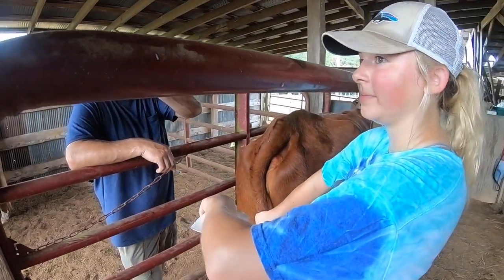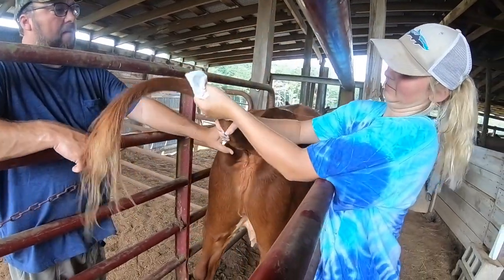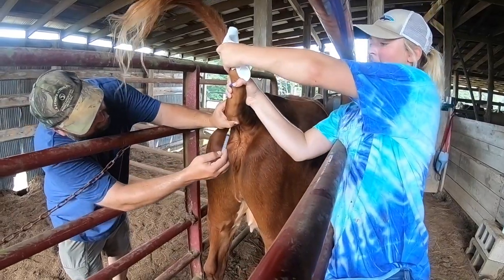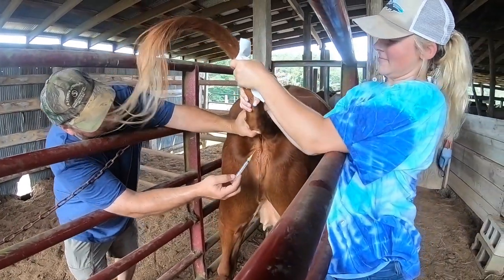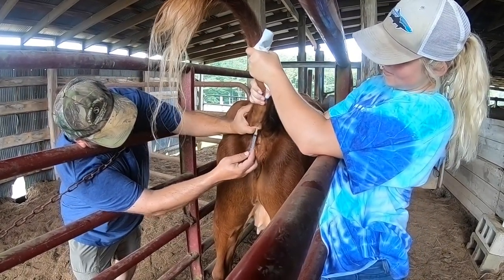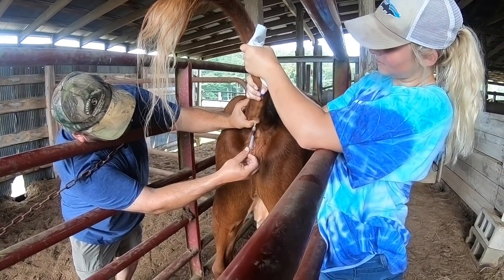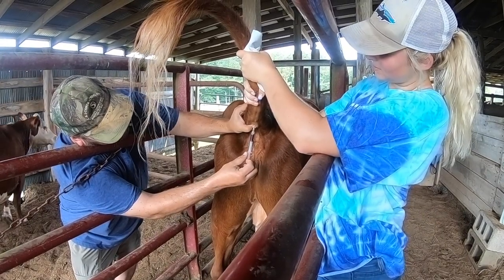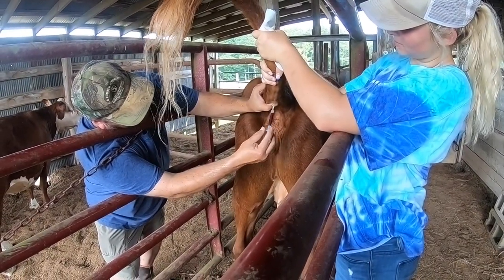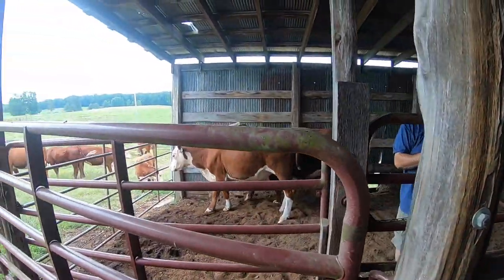Got this one in the head catch. What you're going to do is raise the tail up and find the magic spot — hopefully it's just going to be stable. And voila, you pull about two and a half or three cc's of blood. Then we're going to send it off and get the results to see if they're bred or not. Just like that, we got number one, but we have several to go.